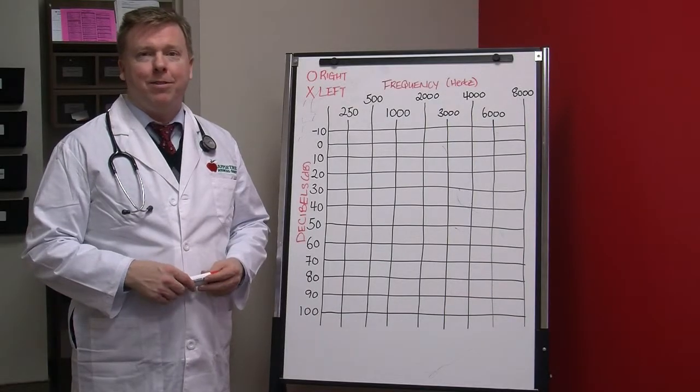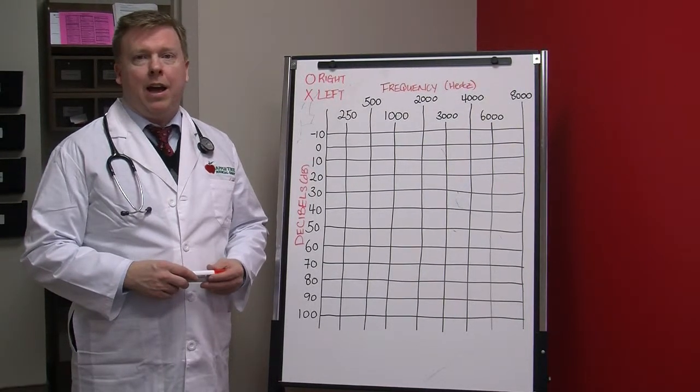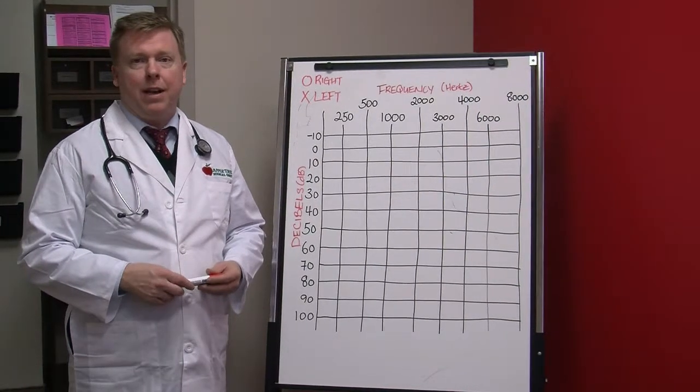Welcome back to Appletree U. In this segment, we're going to cover an overview on how a basic diagnostic hearing test is performed and how it's read.